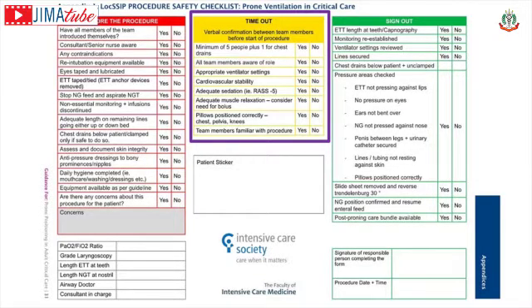He has adequate sedation and muscle relaxation. Pillows are positioned correctly. Infusion pumps can be on one side but can also be on both sides as long as there is enough slack.